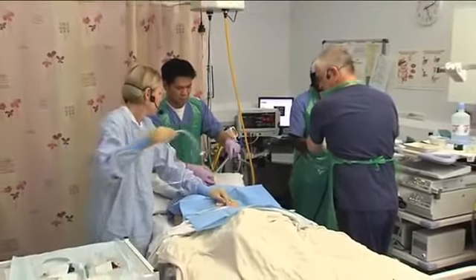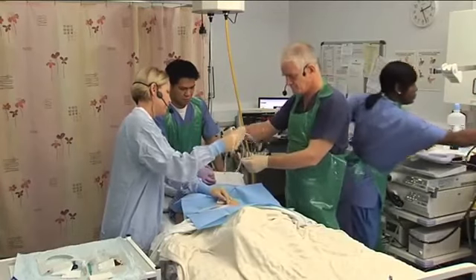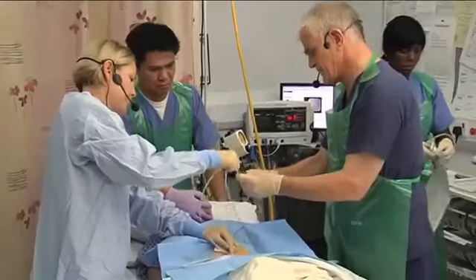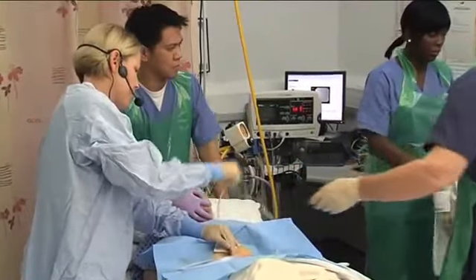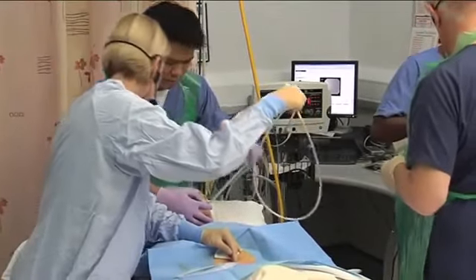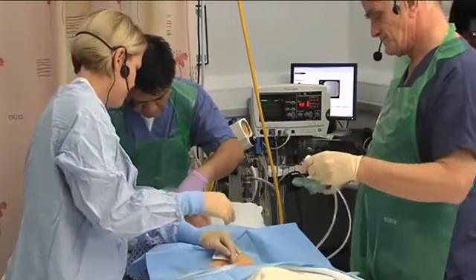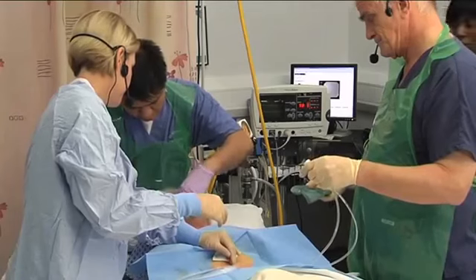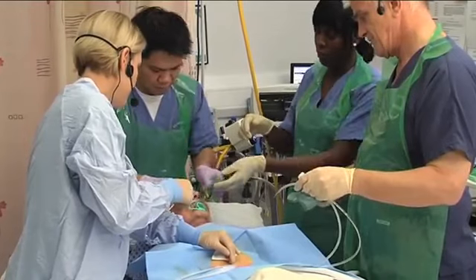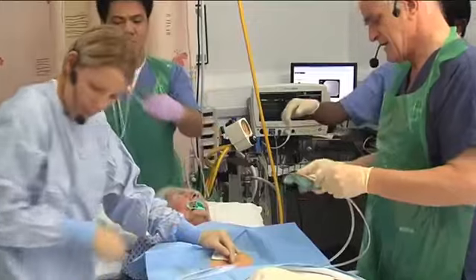Okay, thanks. I now need to put the tube itself onto the wire. Open it up. Okay, that's fine. Plenty of KY. Oh, you can take that feeding tube out of her mouth. Okay, just going to get that out first. Just taking the little tube out of your mouth now. That's it. Well done. Okay, so I'm now going to lubricate the tube.